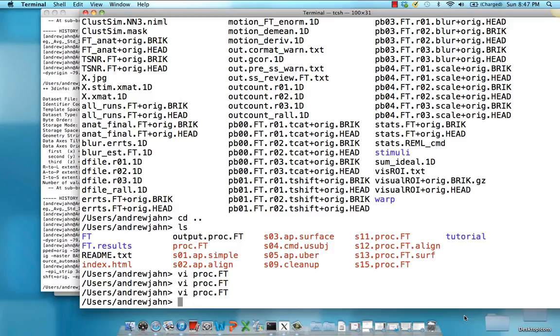Volume registration will calculate how far the subject moves in all those directions, and then attempt to correct for that by moving all of the other volumes to the reference volume.